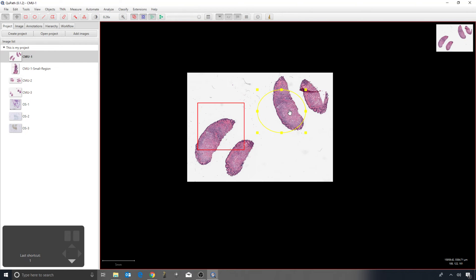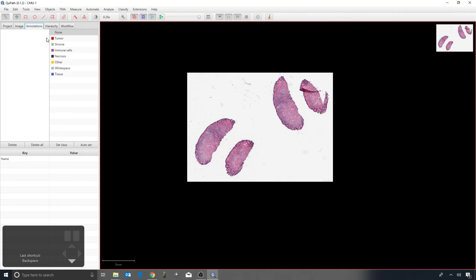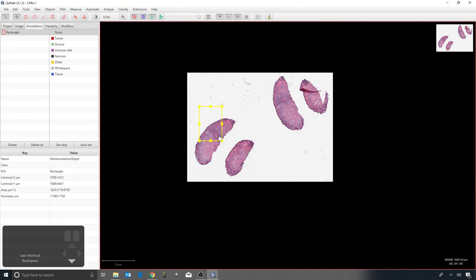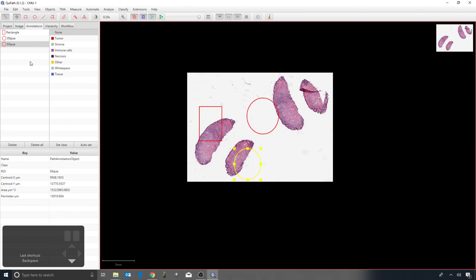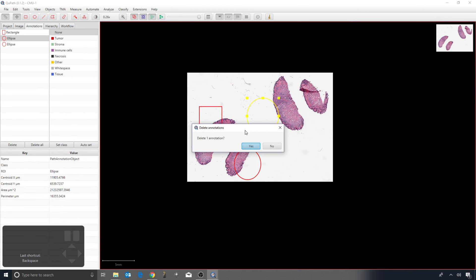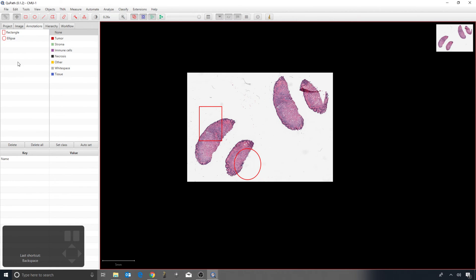Inevitably you'll create annotations by accident that you want to get rid of. You can do that by pressing the backspace key — select the annotation you don't want, press backspace, and it deletes. I'll also click on the annotations tab so you can see that as I draw new annotations they're added there, giving another way to delete them from the list, or click 'Delete All' to remove them all.